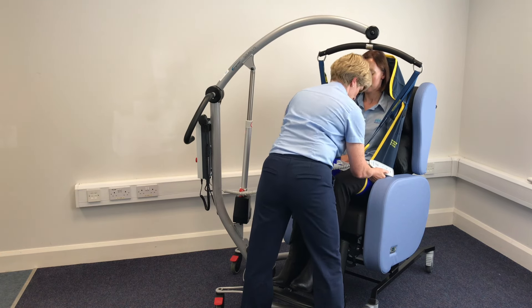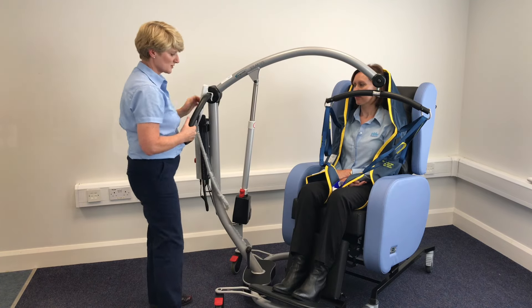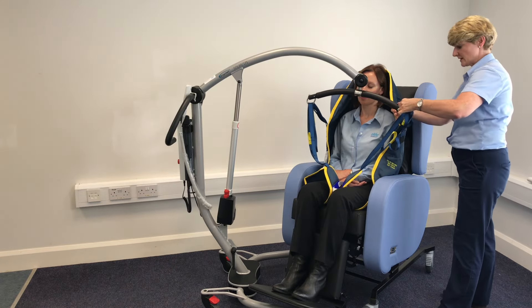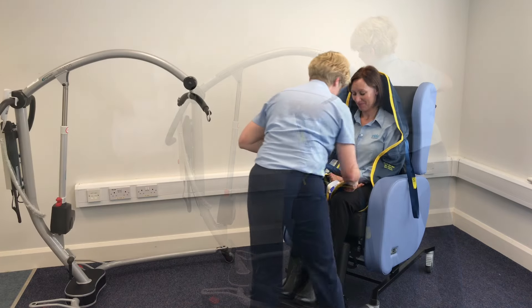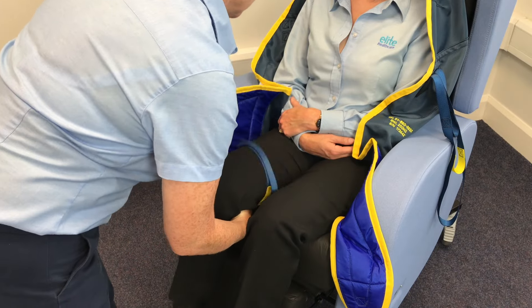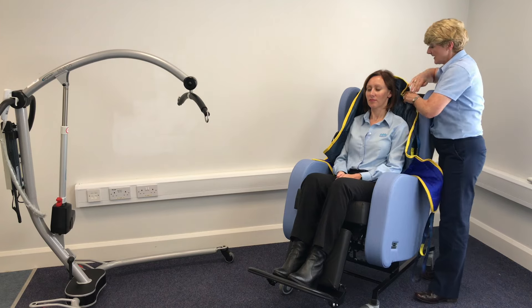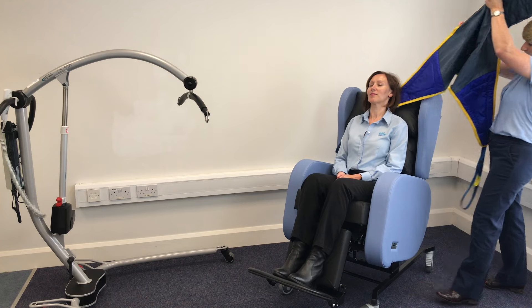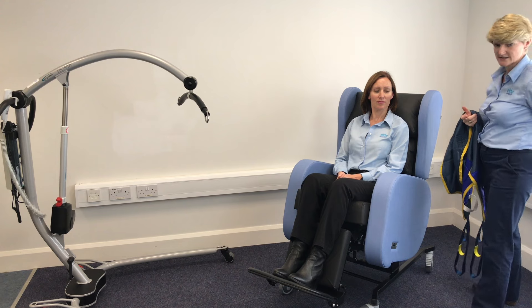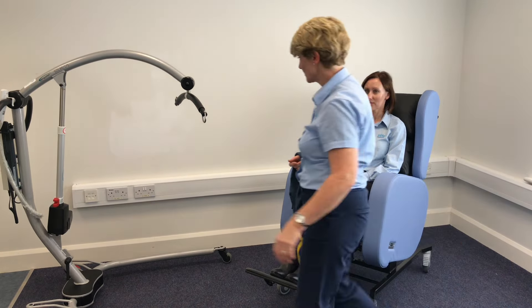So I'm landing in a good position. Your brakes are left off the hoist because that will allow the hoist to draw back and not get in the way of the patient. When taking off the sling, mind your own position — bend your knees. Click out the leg supports. If it's a patient at risk of sliding or readjusting, you can put a little bit of tilt on your chair, and without disturbing the patient at all, the sling will just ride up because it was put on correctly. The bottom trim has just gone to the end of the coccyx, not actually under the patient's bottom. The patient's feet are already on the foot plate, so you don't need to go lifting the legs. And that's your patient safely landed. If you find this video useful, please like and share, and if you'd like more information, contact us at the email address below.